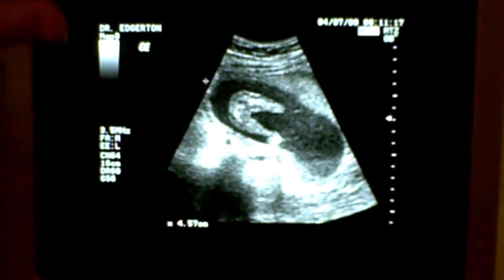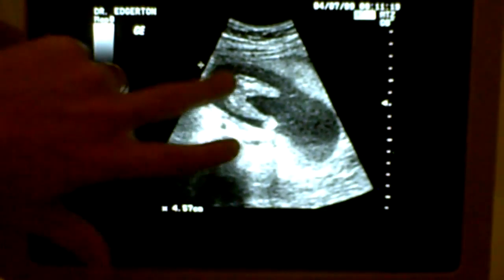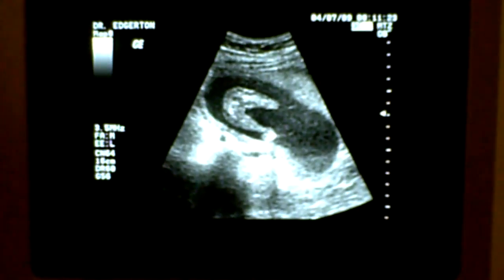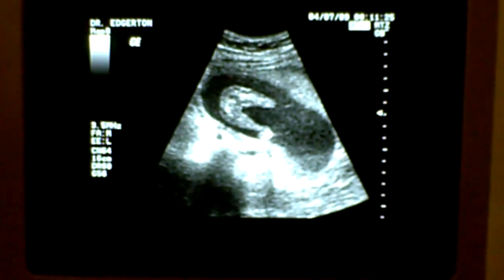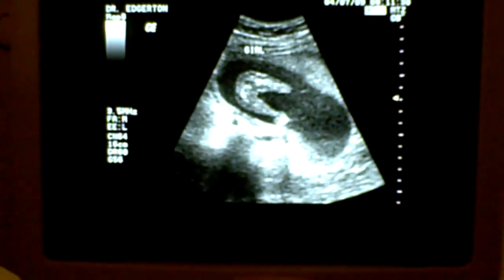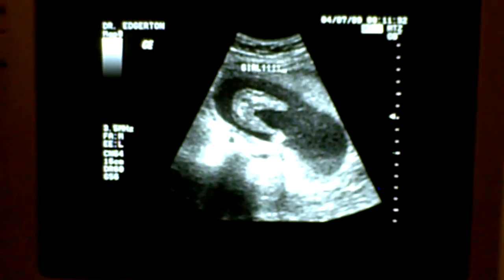It's kind of like the baby sitting on a glass table and you're just looking up — this is the bottom, legs going out this way. I'm going to say I'm about 80 percent sure it's a girl. Think pink!